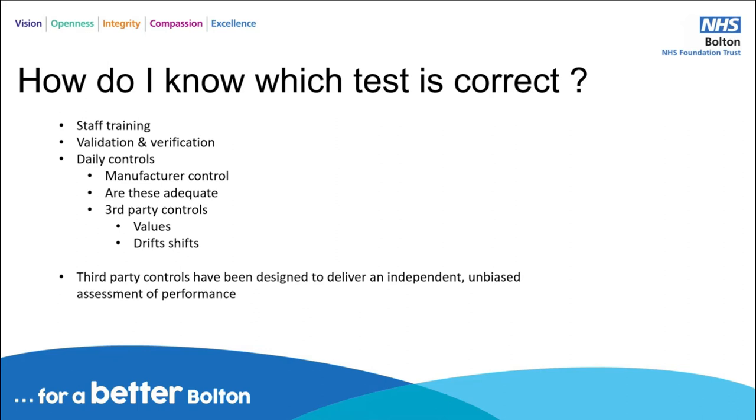We provide that evidence, and we include the control material that we have used in those processes. And we provide them with evidence of the daily tests that we perform. So the manufacturer's control, we discuss whether these are adequate, and we state to the patient, well, your test or your sample fell in line with this, or didn't quite do so in the way that we expected.